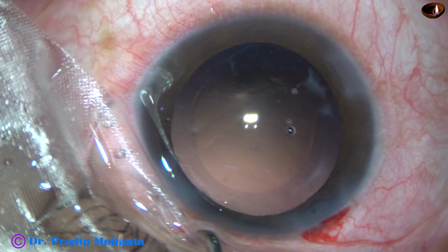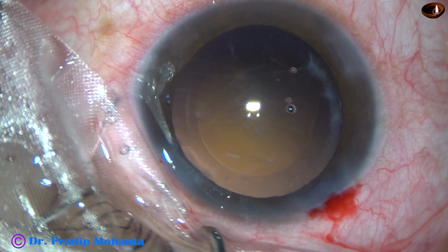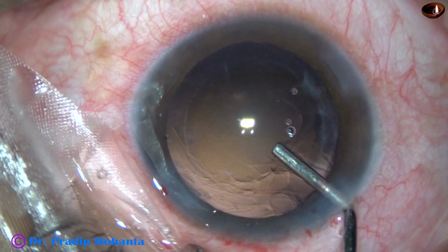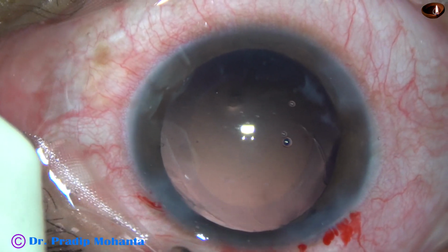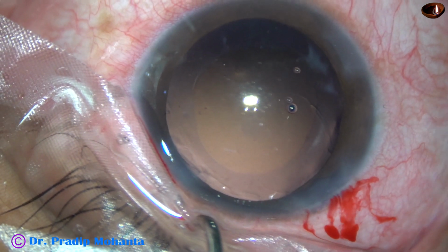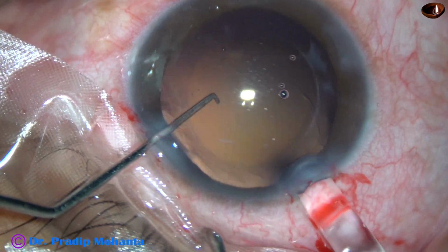And now in this case, we are going to implant a beautiful lens from Hoya, Japan. It has got a beautiful preloaded system, and the device can go through the 2.8 mm incision. The tip of the cartridge can go through the 2.8 mm incision. The incision need not be enlarged. It goes easily through the 2.8 mm incision into the anterior chamber like this.